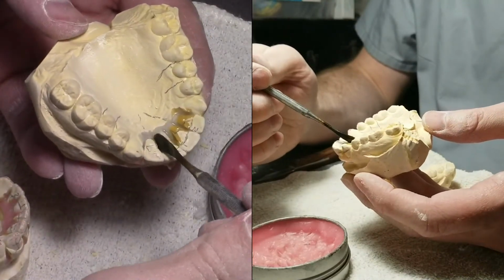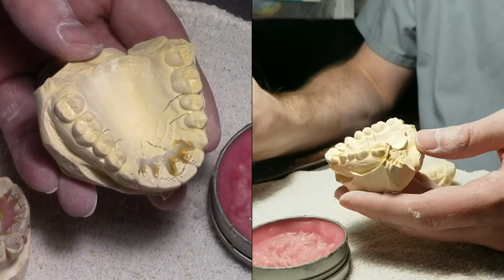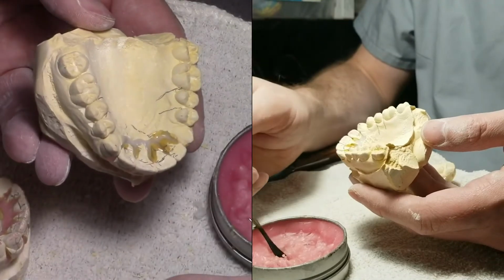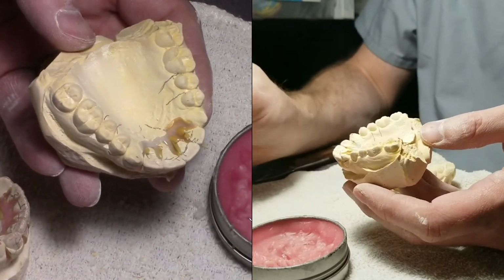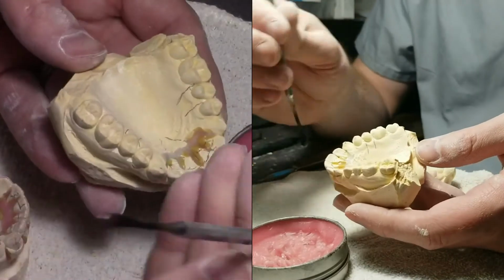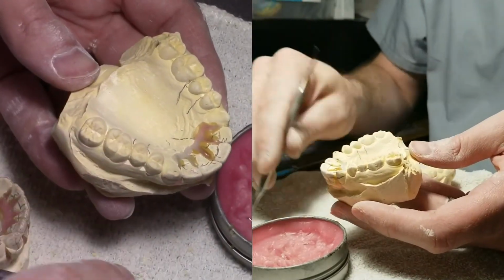Now I'm just waxing. This is just the final part. Put some pink wax in here. That's the bad thing about doing it this way, is you got this gaping hole you gotta fill up. But usually, if you do it right, the cuts you make in your spring retainer are going to be right along this line, so there's not going to be any acrylic there anyway.